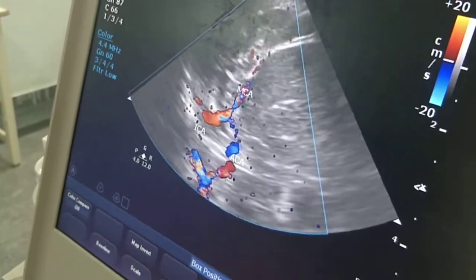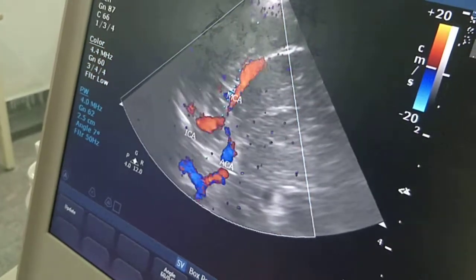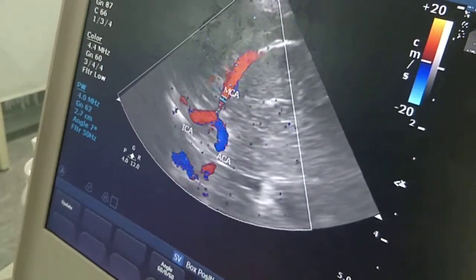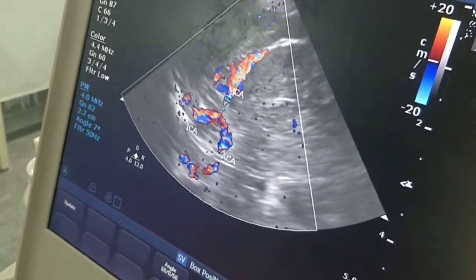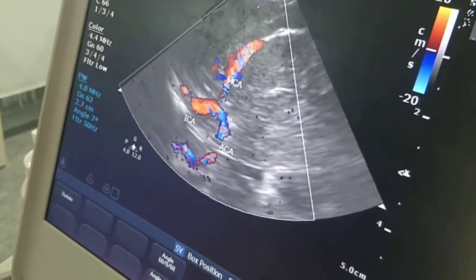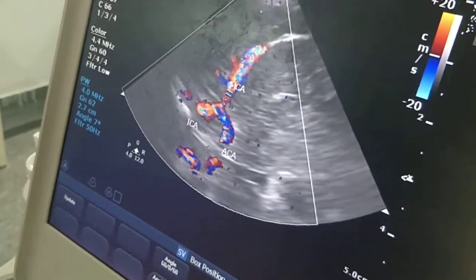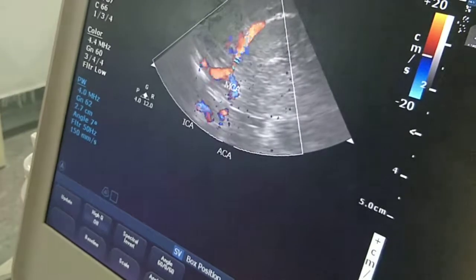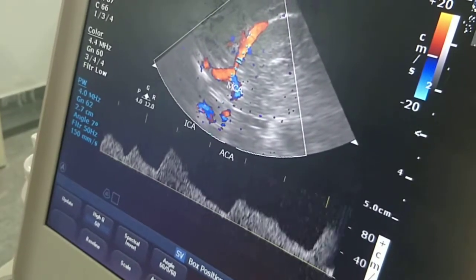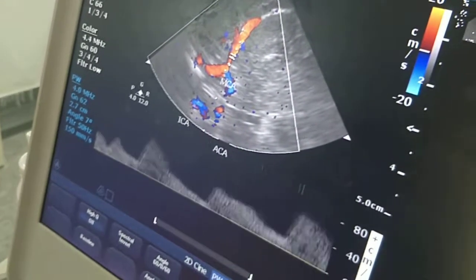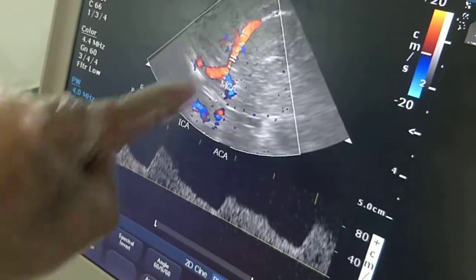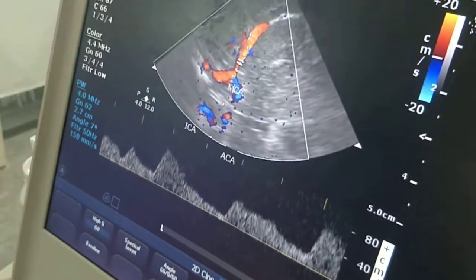You can see that wave — this is the pulsed Doppler of the middle cerebral artery. I'll just take the pulse rate off of that so you can see the waveform clearly.